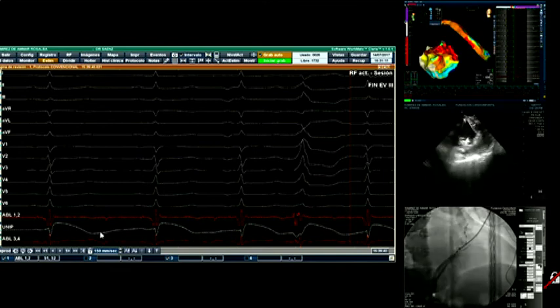The reason for the kinking was because there was a lot of movement in the proximal portion of the right atrium, and there must be a structure there, and the kink of the sheath in the vena cava. When we recognized that and we thought that we had nothing to do in the coronary sinus, we decided to take it all out in order not to have problems.